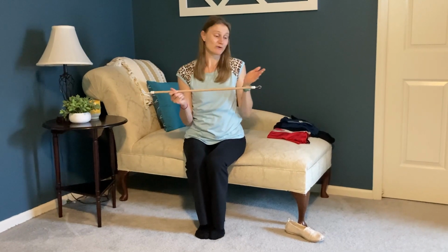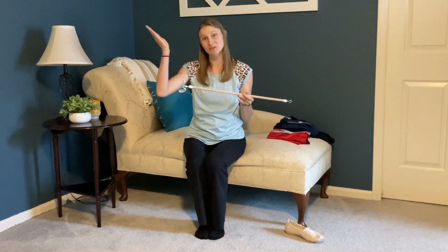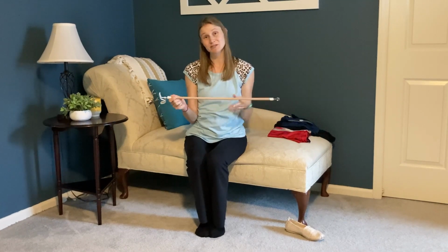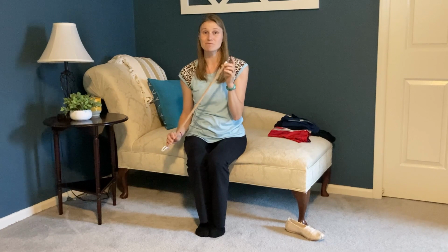The first and foremost component is the long rod in the center, the stick part of the dressing stick. This is the part that elongates the device to make it easier for you to reach either down to your feet or things up overhead if you have limited range of motion in your back, your hips, or your shoulders. At this end is a metal hook. You can use this to hook or clasp onto things, but the gap to fit in there is pretty small.